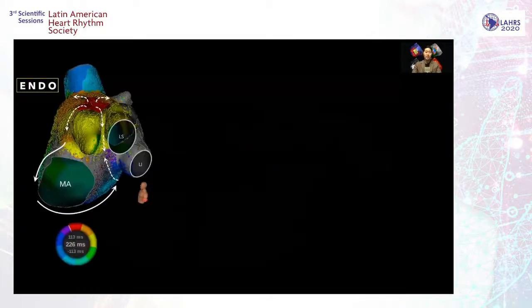This would be an example of, again, mitral flutter activation with focal breakout at the top of the roof that comes back to this line. Here we have the same types of pattern where you have something that jumps beyond the line. You have to suspect epicardial bridging.